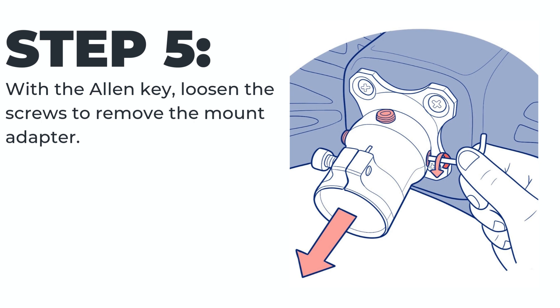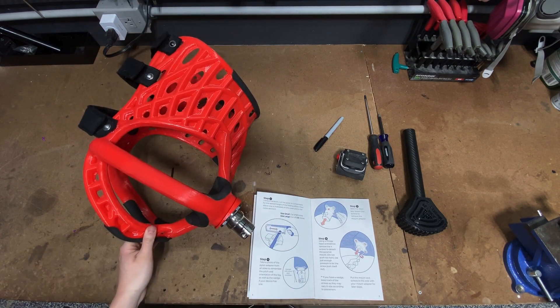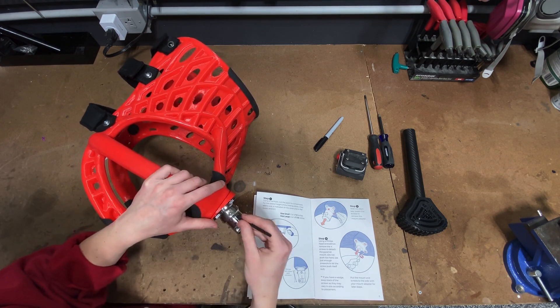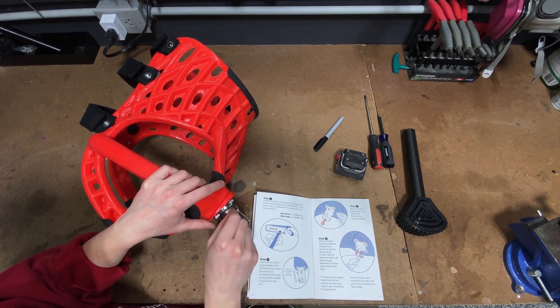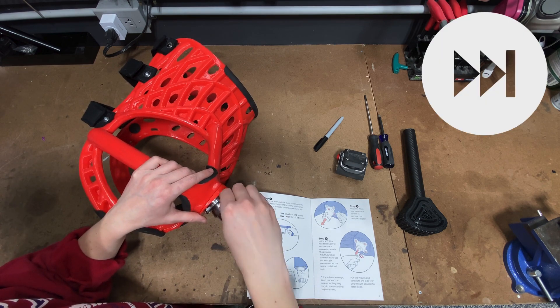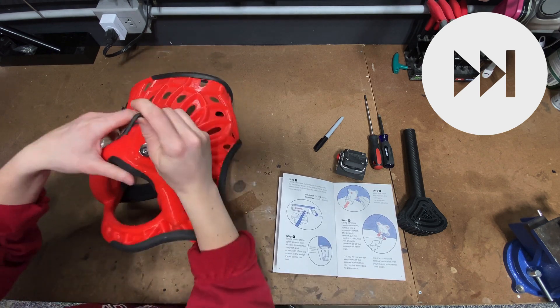Step five: with the allen key, loosen the screws to remove the mount adapter. Do not remove the screws all the way — just loosen them enough that you can easily slide the mount adapter off the pyramid mount. These screws were secured with adhesive when your device was built, so if they are difficult to get started, that's okay. If that's the case, insert the shorter end of your allen key to get more leverage. Twist back and forth to break the seal and then continue to unscrew.